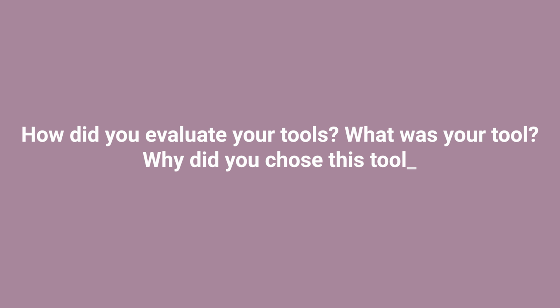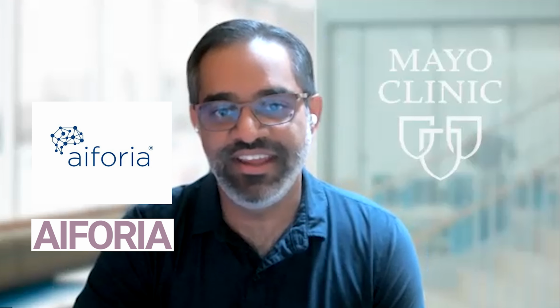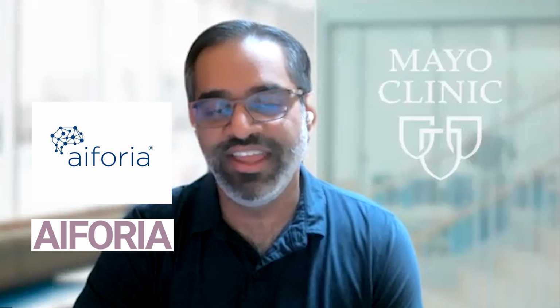How did you evaluate your tools? What was your tool, and why did you choose this tool? Yeah, so I used Aiforia. It's a commercially available software, and it was something that we actually had a subscription to at Mayo Clinic. We use it for education. It's an easy way to share images, and if I'm giving talks somewhere else, I can pull up the Aiforia hub and share that.